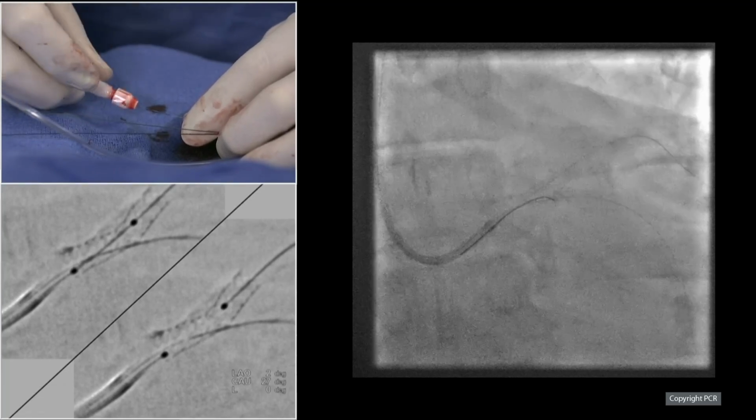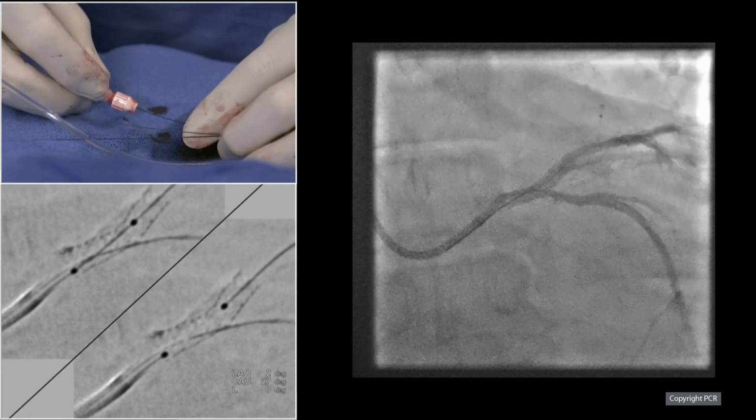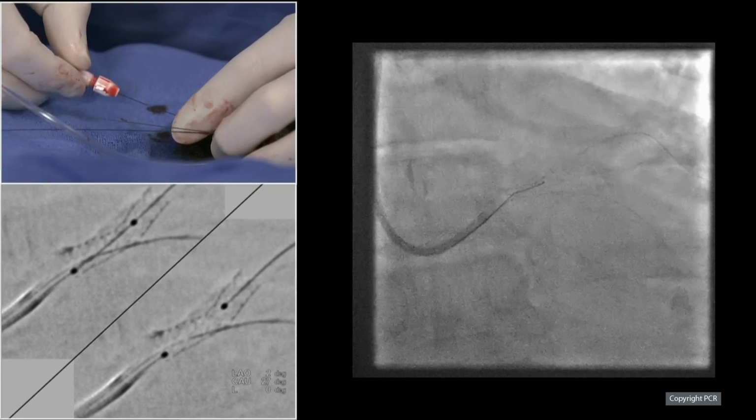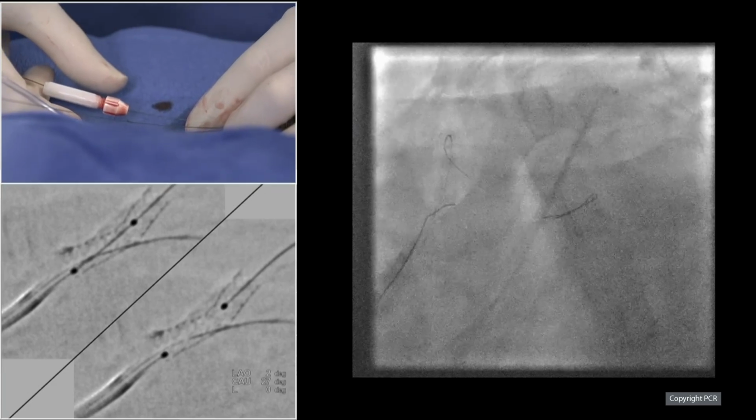There we go. Close to the exit. No. Take care. Yeah. We could change to the spider view. Yeah, the spider view would help because I agree, there is a real stenosis after the angioplasty left main to LAD.